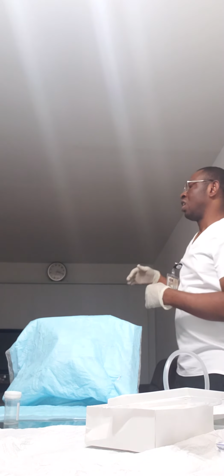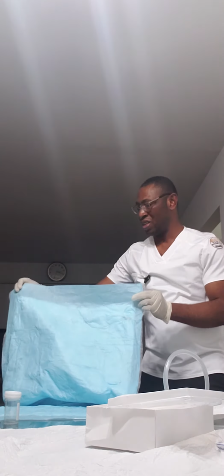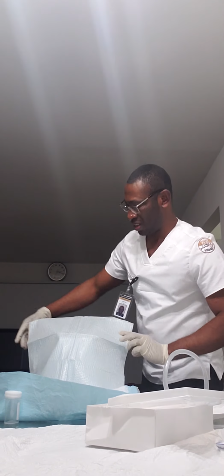The next thing I'm going to do is perform hand hygiene, wear my gloves, get the bed up, and remove the handrail.